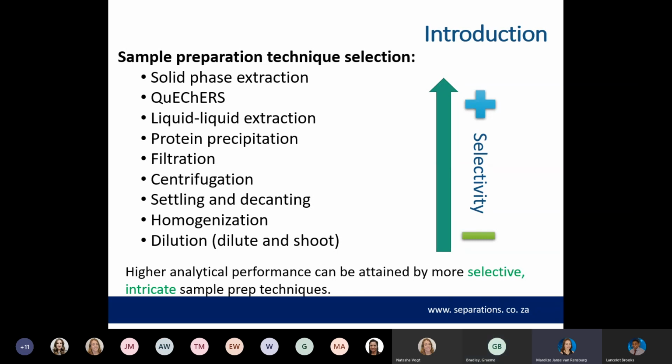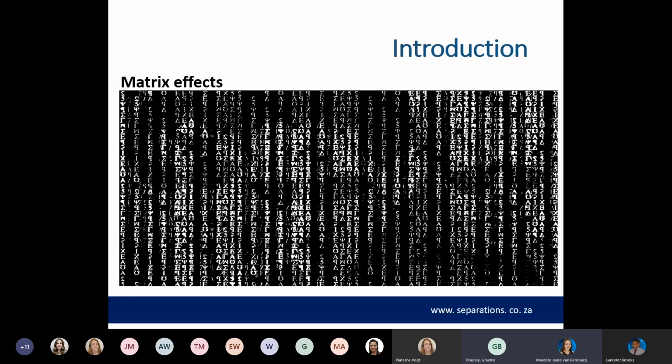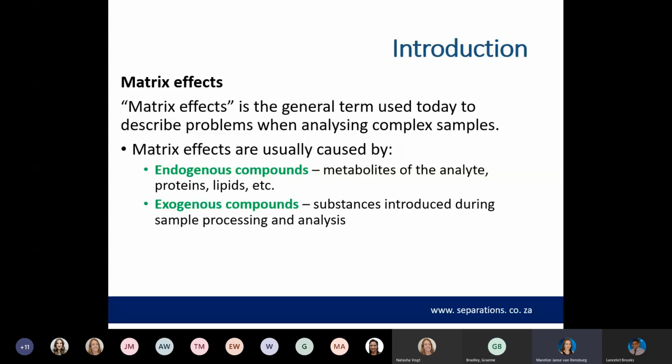So looking at sample cleanup, let's consider the matrix effect. Now, I'm not talking about the movie starring Keanu Reeves. And if it's not a movie, then what am I talking about? So the matrix effect is a general term that we use to describe problems when analyzing complex samples. The matrix effects can be because of endogenous compounds, that's part of your sample, especially in biological samples, these would be proteins or lipids, or it could be compounds introduced into your sample during sample handling, and plasticizers is a big one that we see in this category.